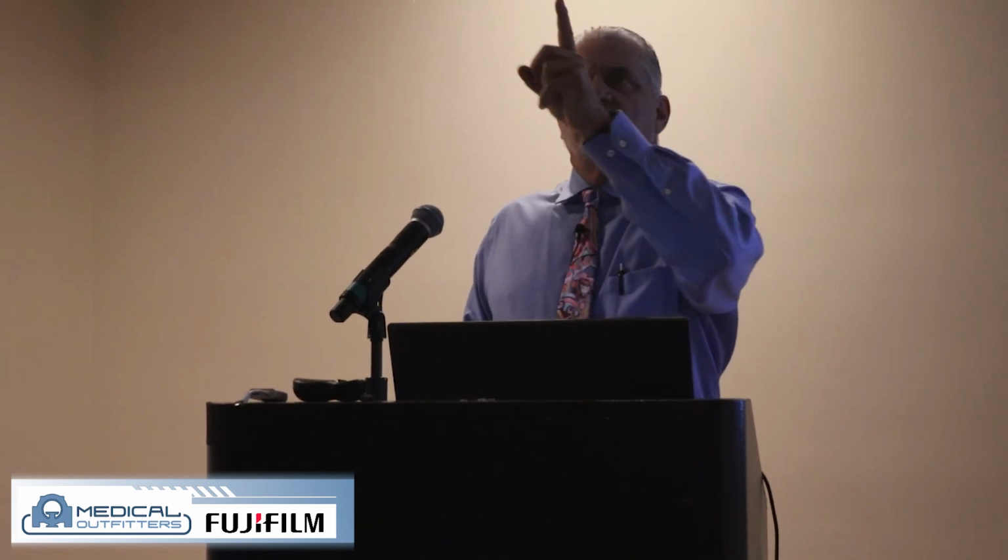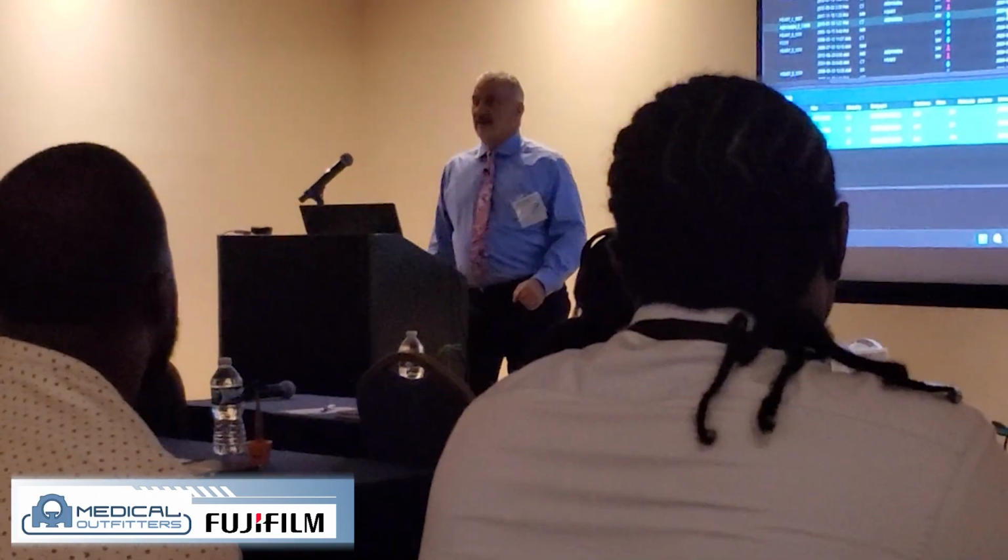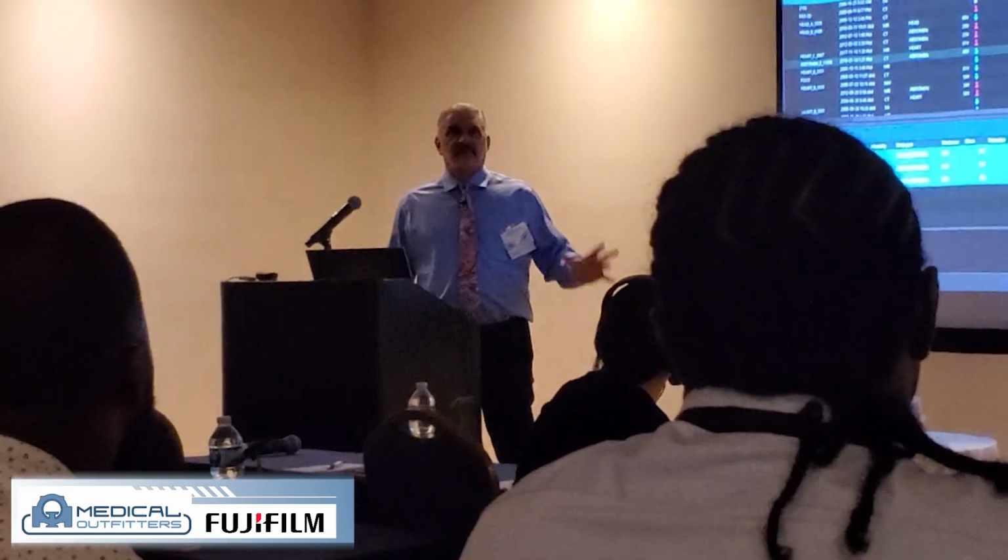Now, if you do it retrospectively, you're going to go back to the sinogram data, the helical spiral data, and you're going to grab that data, and you're going to say, hey, between the R to R, I want to grab 10, 20, 30, 40, 50, 60, 70, 80, 90, and you would reconstruct it, and you're now trying to find the best phases that represent the resting phase, a no motion image on the coronary arteries, like 70, 75, 80, typically great for the left side of the heart. It shows the LAD and the circumflex really well. But if you're looking at the RCA, you might have a great heart rate, down at 60, but it gets that little bit of quiver at the end, that mechanical quiver on the RCA, and you might have a little bit of motion on there. So there may be a reason to step back and do that for that.